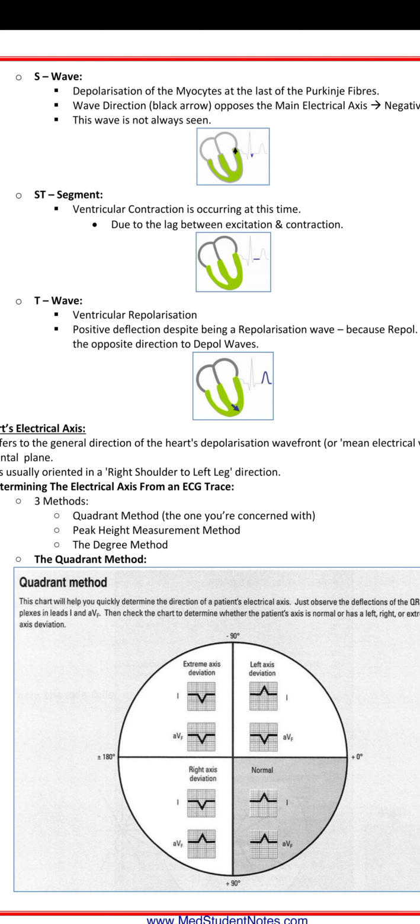Due to this lag, a straight line appears, that is the ST segment.